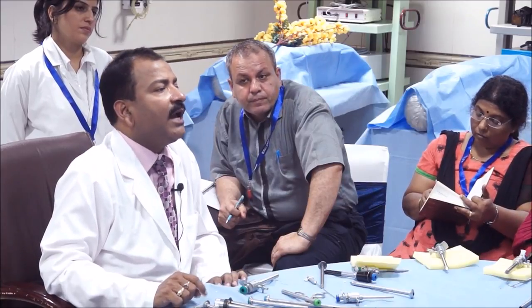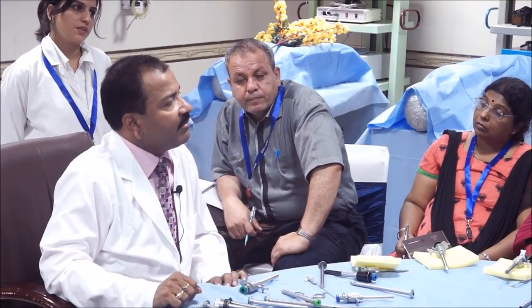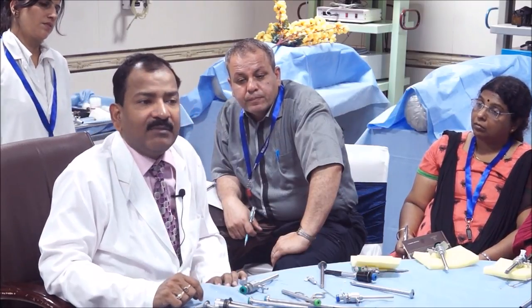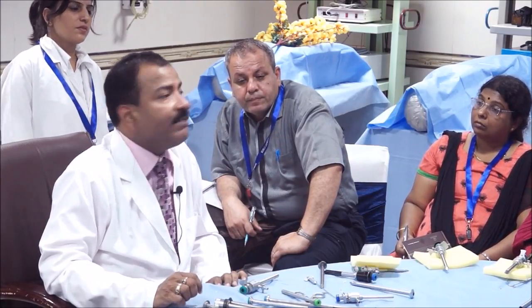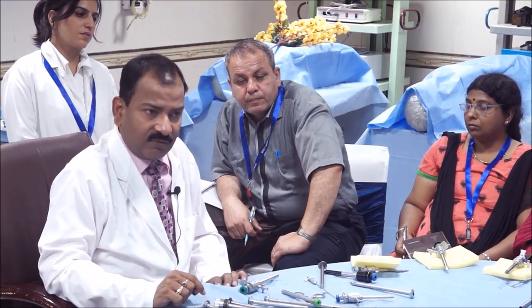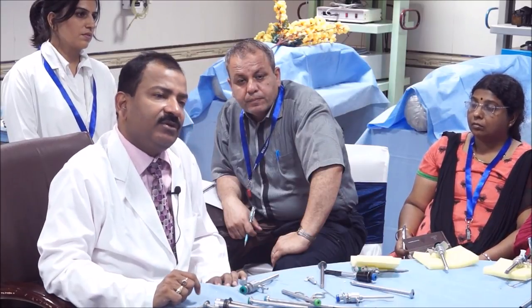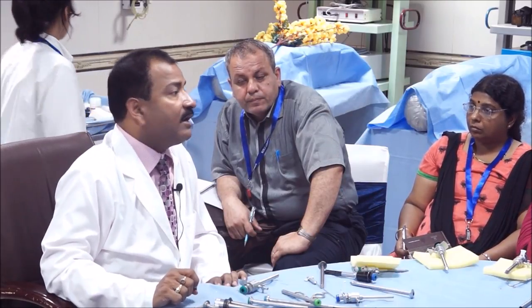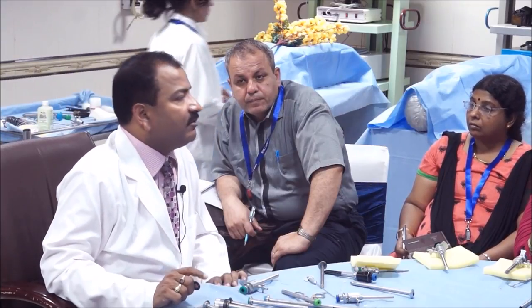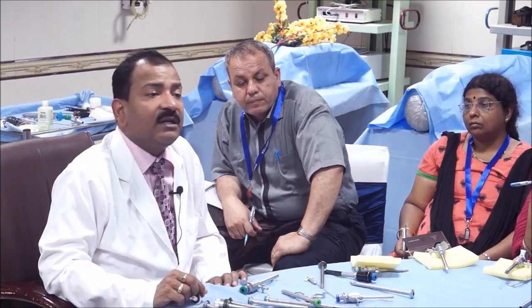Do you know, if you have a 5 mm telescope, then even only 1 10 mm port will do, because at the time of tissue retrieval, we will put the 5 mm telescope in the 5 mm port, and the 10 mm we will use to retrieve the tissue. But suppose you don't have a 5 mm telescope, then you have to use 2 10 mm ports. Some people do reverse feeding, that is not recommended.